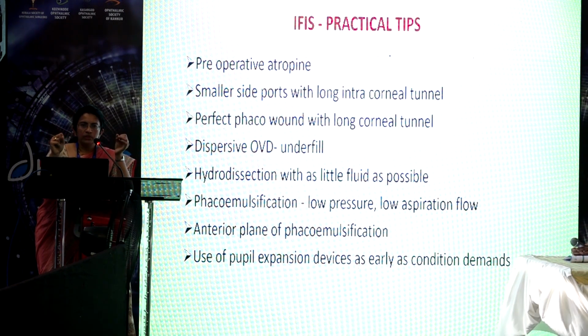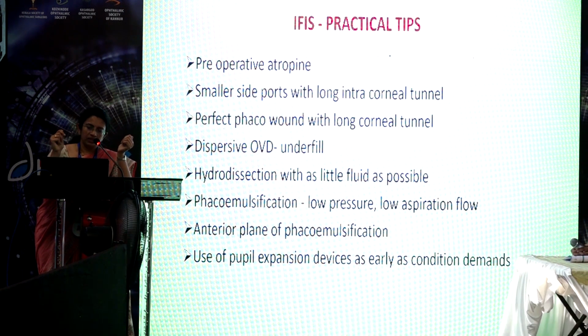And you should always use pupil expansion devices whenever it is needed.